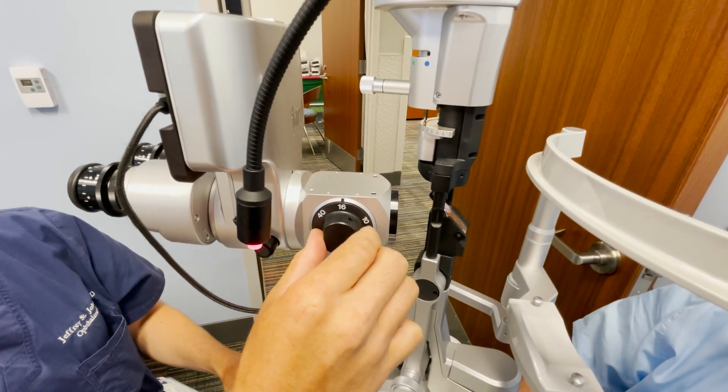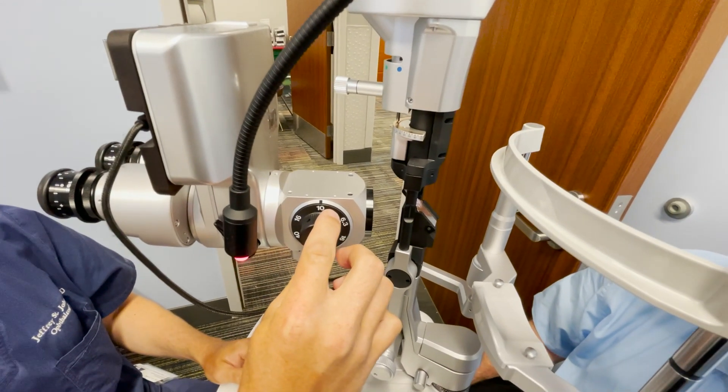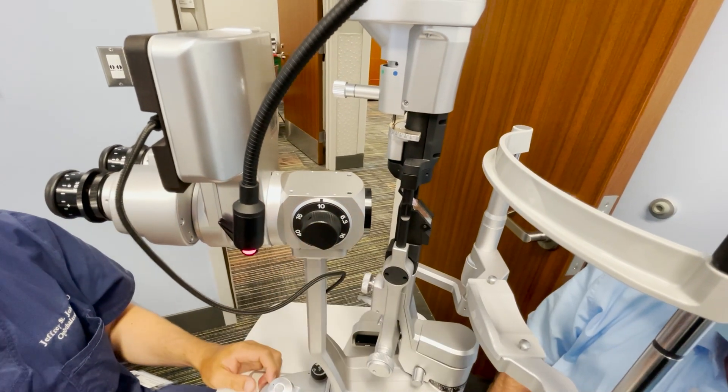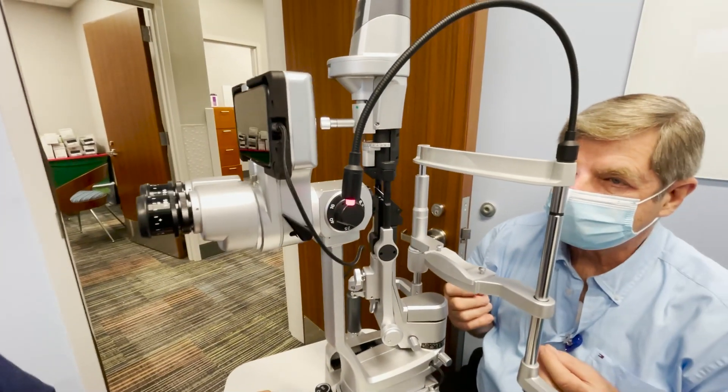For magnification, 16x is usually adequate to look for cell and flare, inflammation, and hyphema. 10x is typically your baseline — how you just want to look at the eye for a standard exam. The higher the magnification, the more difficult it is to work with instruments.